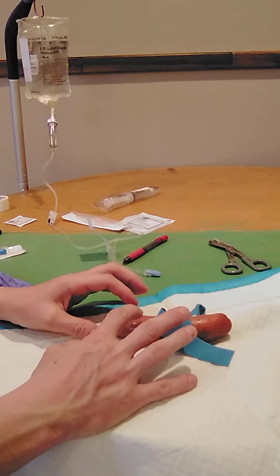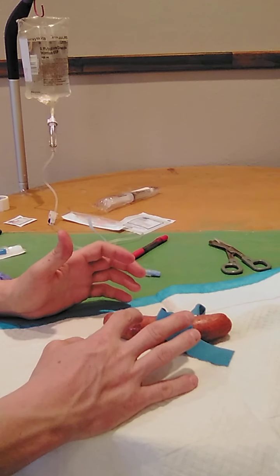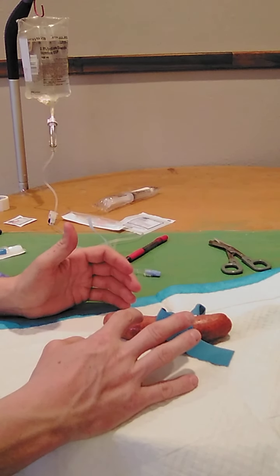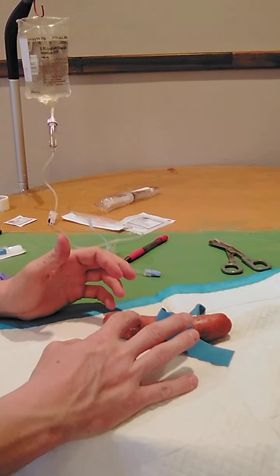I'm palpating. So I've found the site that I want to pierce with this IV set. It's hanging dependently, and it's the most distal place in the extremity that I can find.